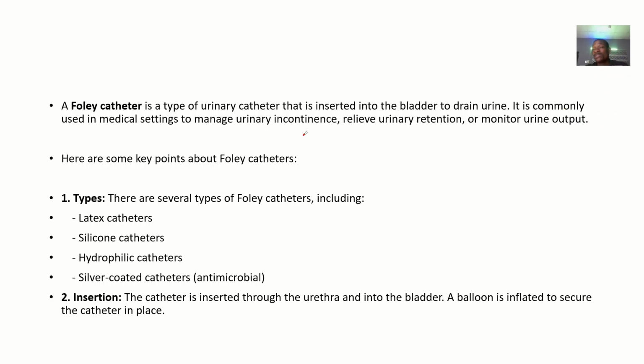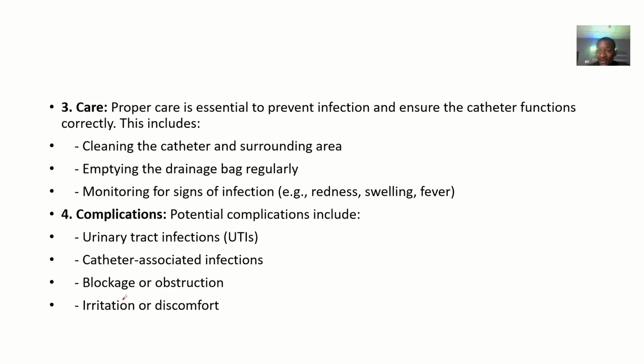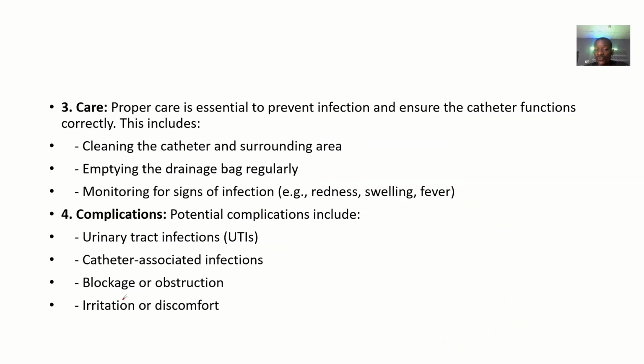We'll be discussing it straightforwardly, from the definition to the types, to the insertion technique, to the care of the patient, to the complications that could result, and basically how to remove this. Okay, so moving on.